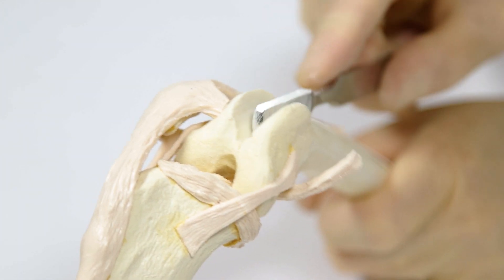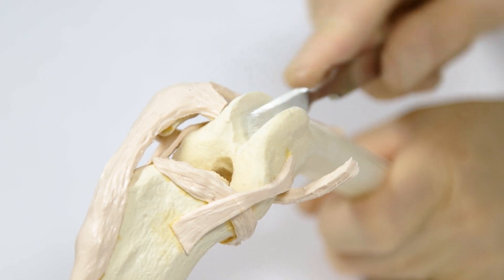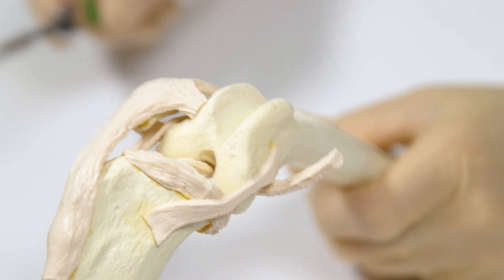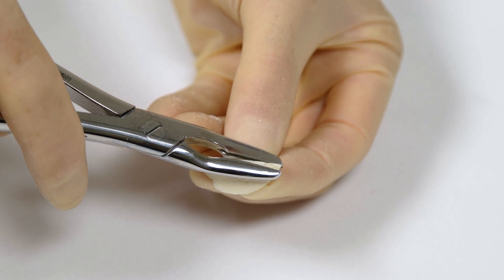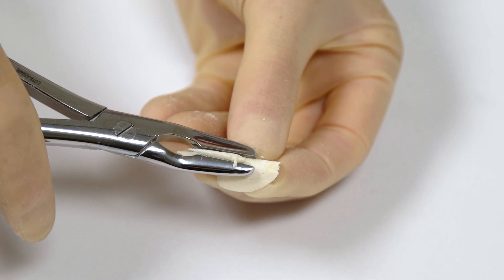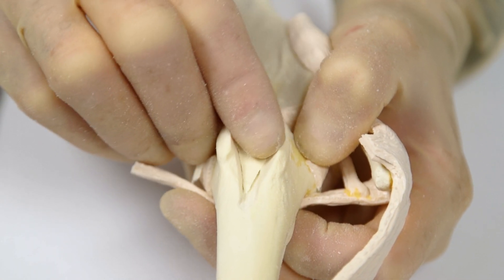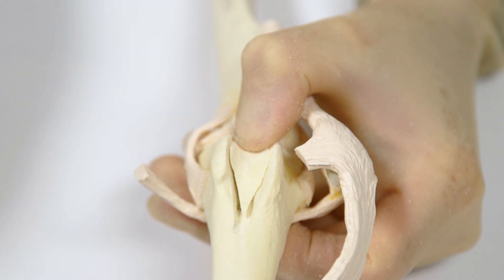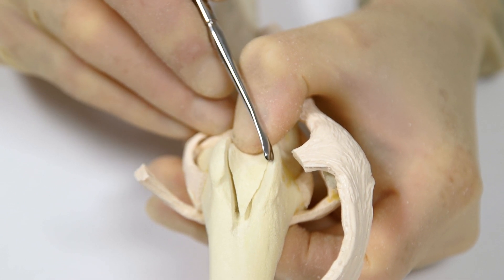Alternatively, a thin slice of bone may be removed from the wedge itself, but this is much fiddlier and more difficult and will result in loss of articular cartilage. If necessary, subchondral bone can be removed from the apex of the wedge using rongeurs to improve fit and stability. The osteochondral wedge is then repositioned in the graft site. Fit, stability and depth of recession are reviewed and adjustments made as necessary.